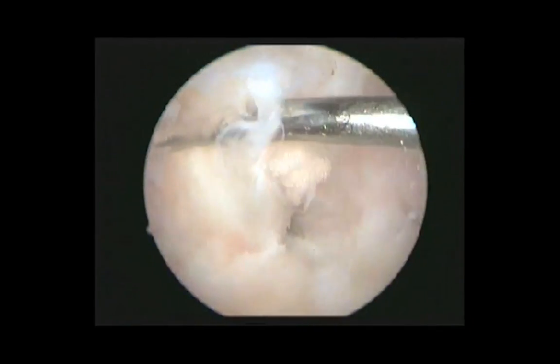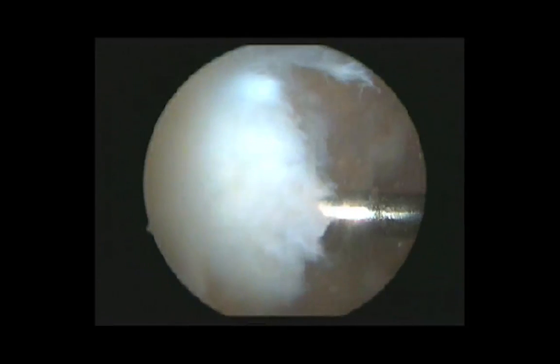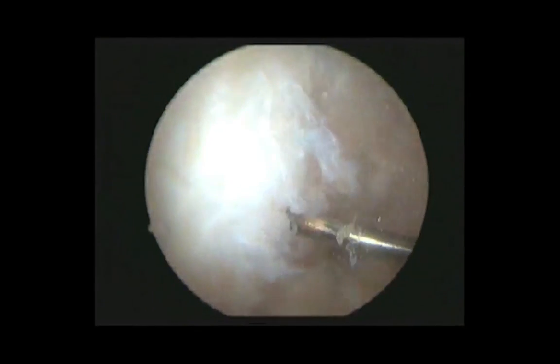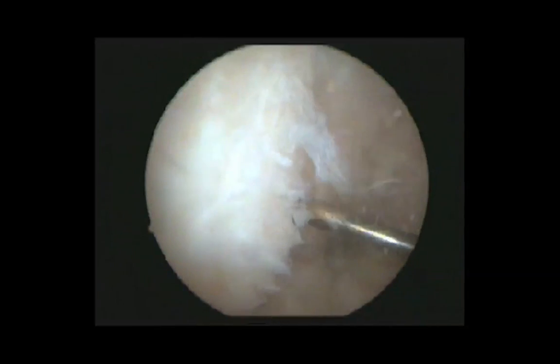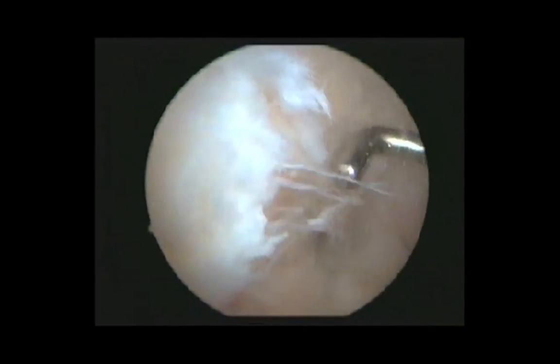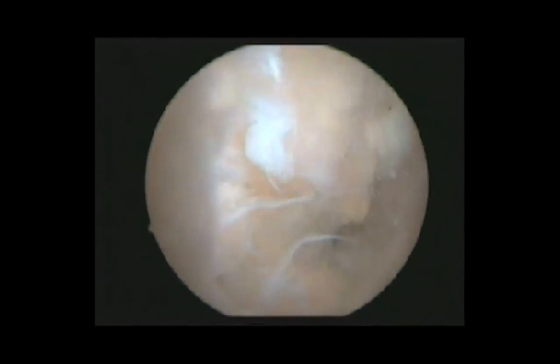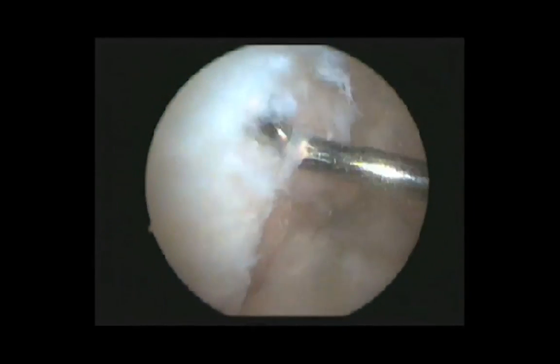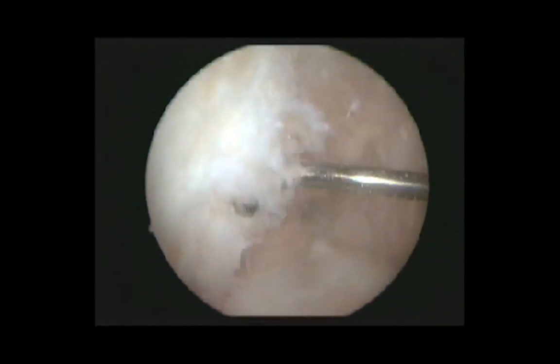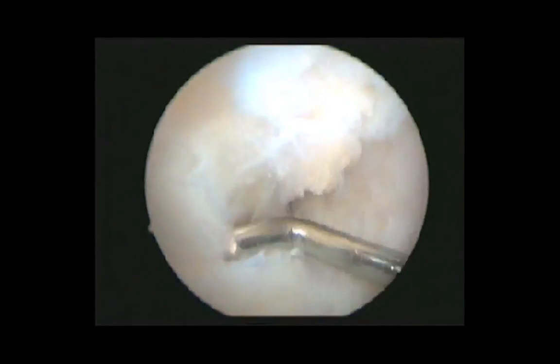You can notice healthy intact PCL just posterior to the cyst wall, and these are the remnants of the cyst wall attached to the lateral surface of the medial femoral condyle. Few fibers of PCL can be noticed in the cyst wall, which you can see as shreds extending into the intercondylar area when we probe it. We thoroughly debride all the cyst wall from the medial femoral condyle so as to reduce the chances of recurrence of the cyst.